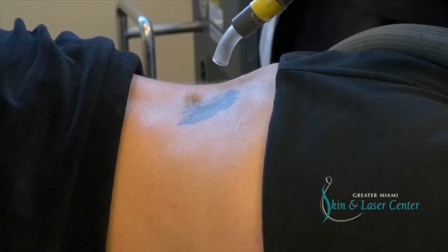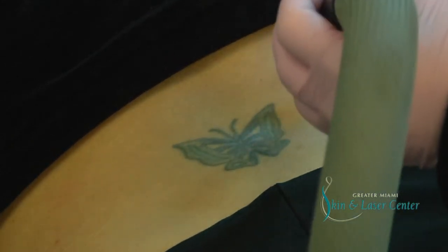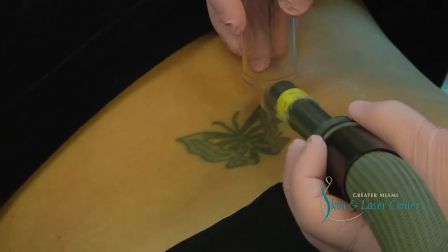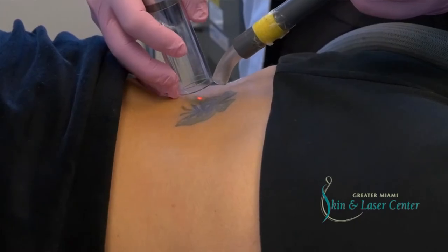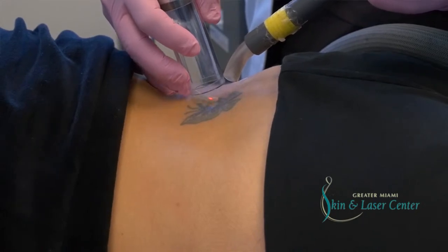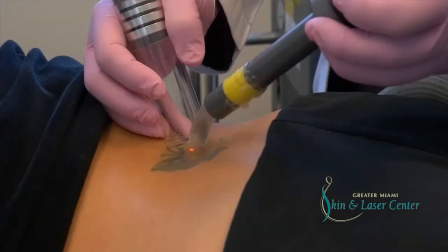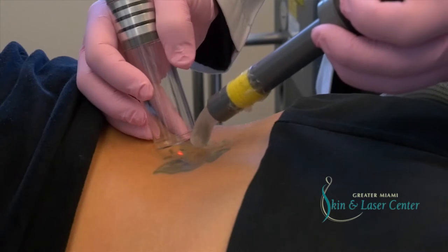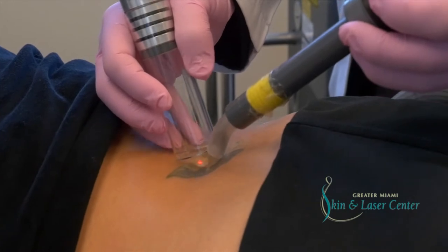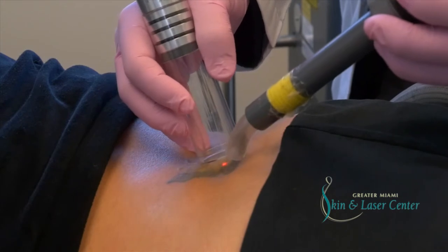I'm going to do one little pulse so you can see what it feels like at first. You're going to feel one little zap and then I'm just going to keep going. That's the worst of it.